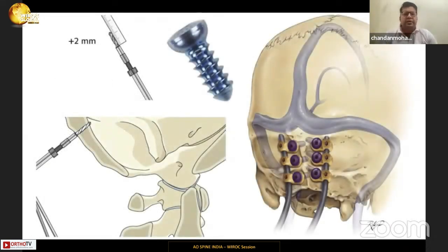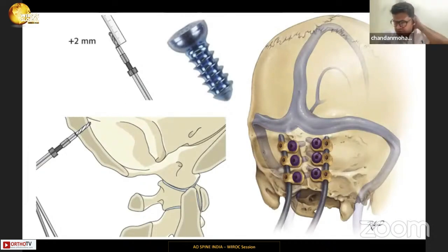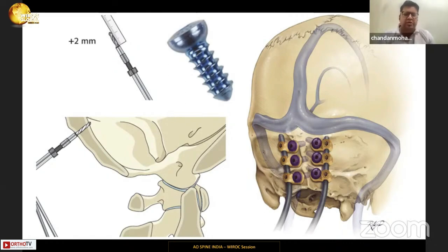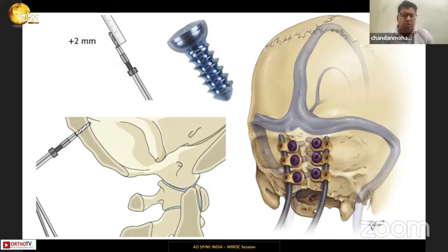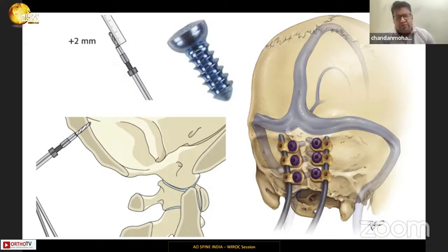Starting with the occipital screw — the easiest way to place it is to first identify the external occipital protuberance, which is the prominent landmark in the occipital area. Screw placement should not be done cranial to that because large dural venous sinuses are present and bicortical screw placement there can cause torrential bleeding. The occipital screw is placed inferior to the external occipital protuberance, around the occipital keel, which is the thickest part of the occipital bone.